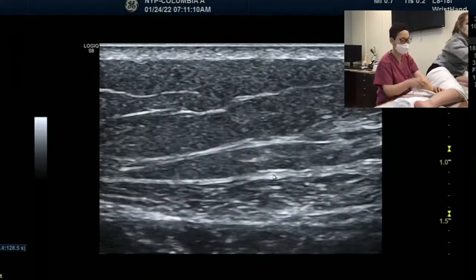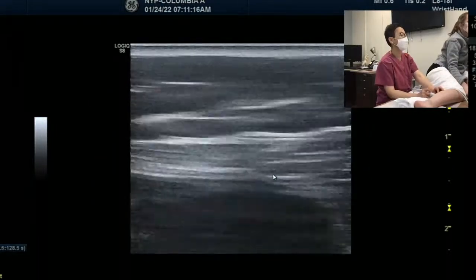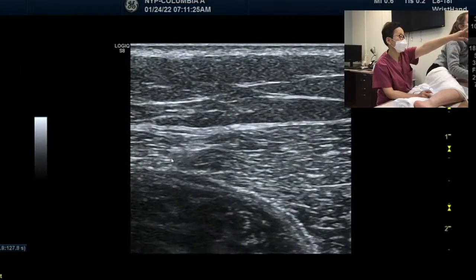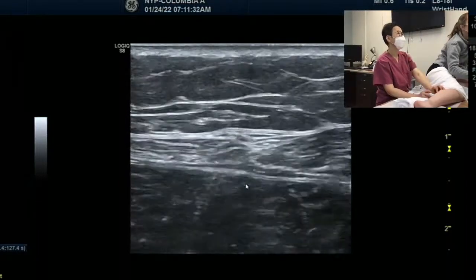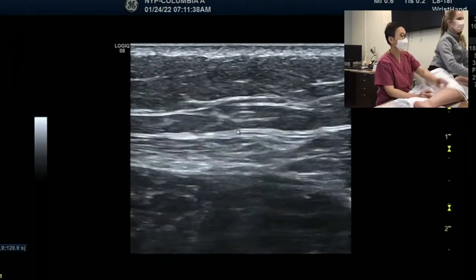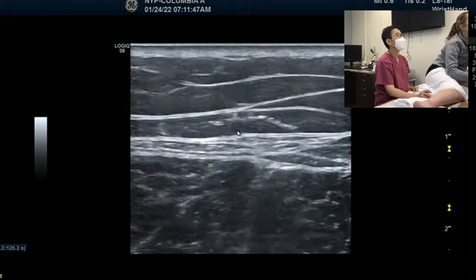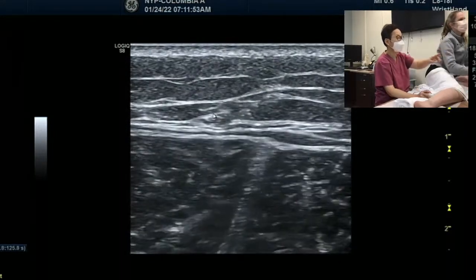For now, it's very hard because we are using the hockey stick probe. But this is almost in the middle, the fascia line, I see it. The underneath is the medial, the right top is the lateral gastrocnemius. So it's going to be in the middle here. We just had it. See over there, it's moving, inside of the fat. It's going down again. Do you see? It's moving.